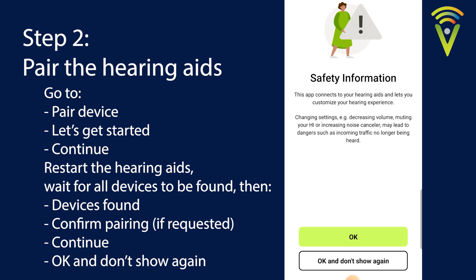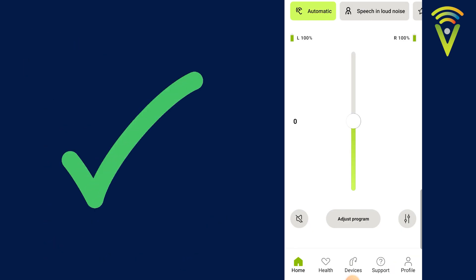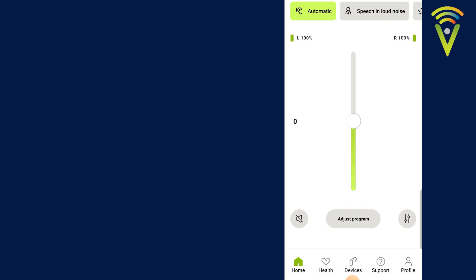On the safety information page you can select Okay and Don't Show Again. And there you go — we've unpaired and repaired the hearing aids to the My Phonak app. Hope that was helpful.